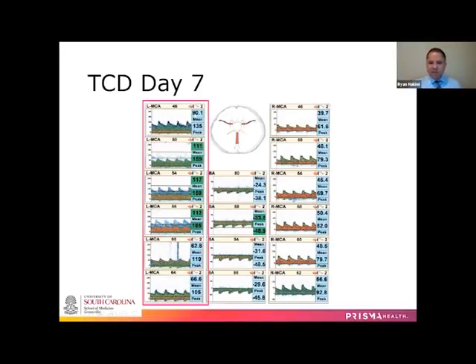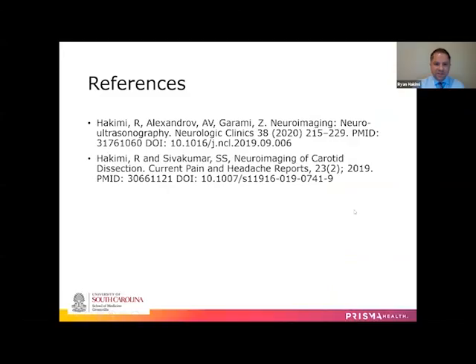And so being that it's day 7, being that the patient's clinical exam is unchanged, and being that you have this supportive evidence that that area of stenosis, or basically the clot, is actually starting to open up, you feel much more comfortable sending the patient out of the ICU. And that's where the role of TCD can help you in making an appropriate clinical decision.